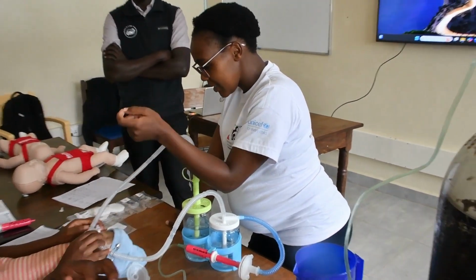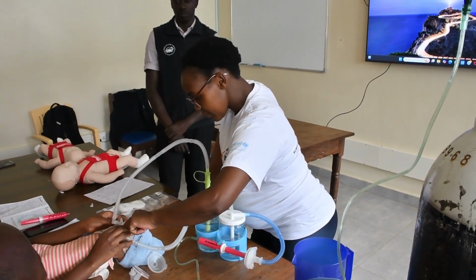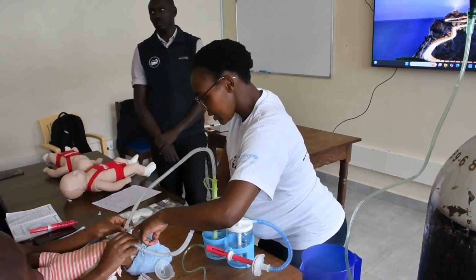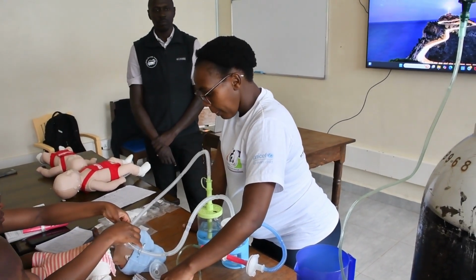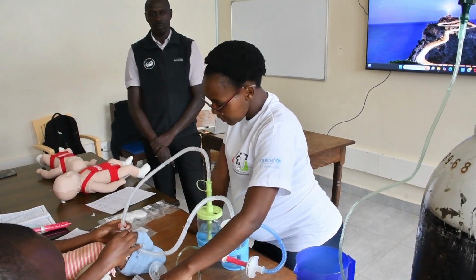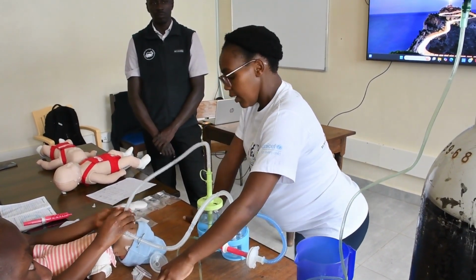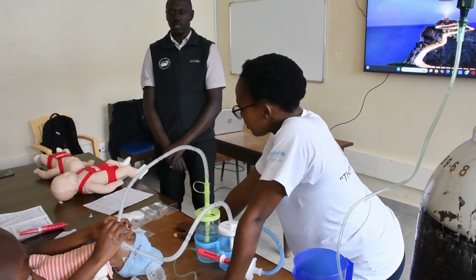It should be just 2 to 3 millimeters from the nasal septum, so that it does not cause injury. To the patient, you should also check. And then the other thing is prevention of nasal injuries.